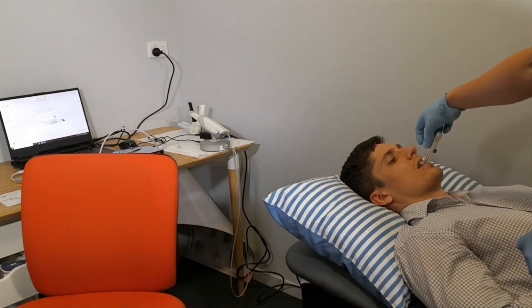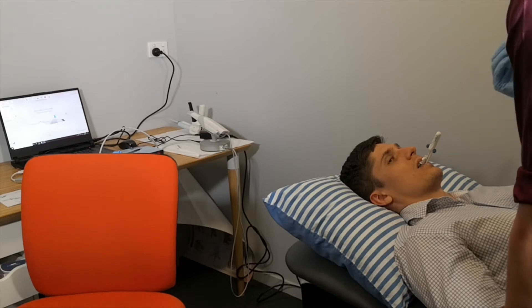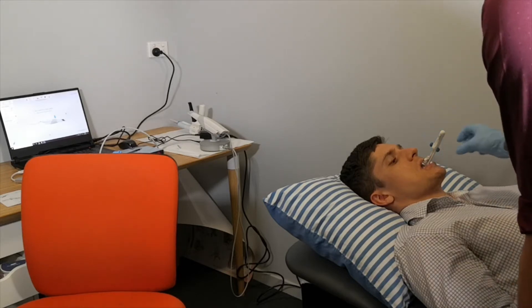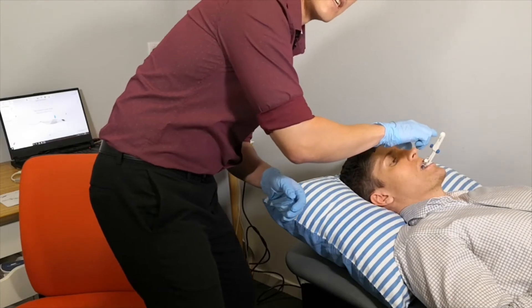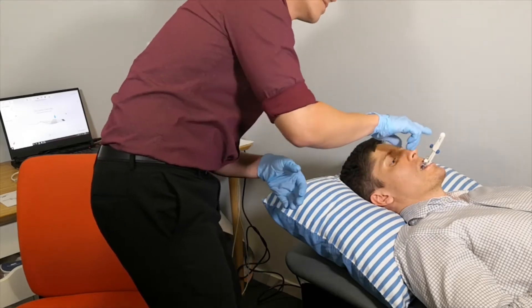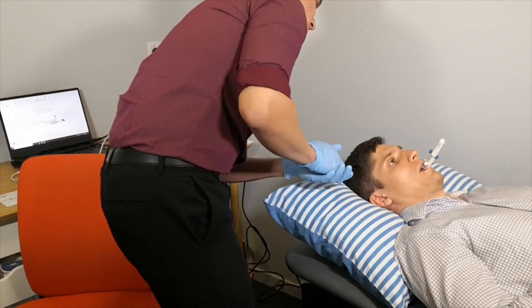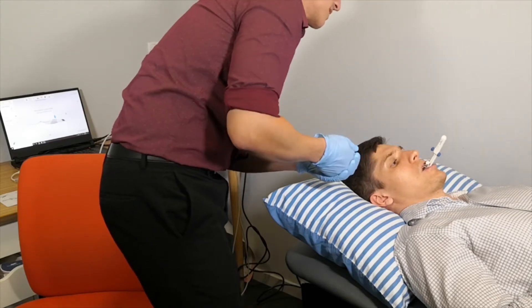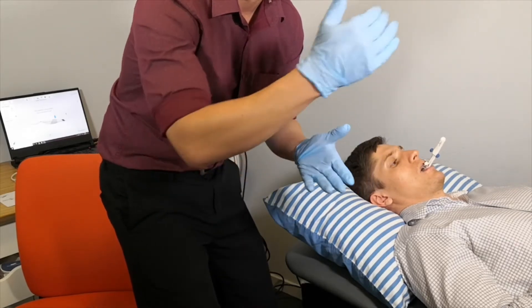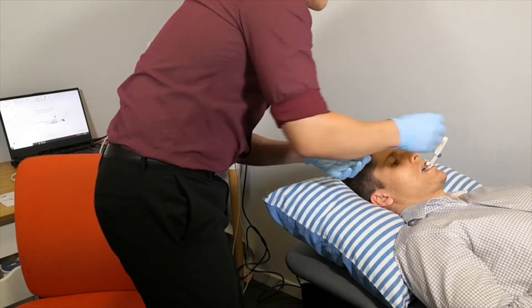Now the top part of the actual gauge is unlocked and free. I'm going to get Callum to protrude his jaw while biting on it — can you bring your lower jaw, your mandible, as far forward as possible? Now we can look at the actual ruler on the gauge itself to see how much into the positive, or how far forwards he can achieve. Take a note of that number, then get him to retract the mandible as far back as he can go. You get them to do it a couple of times so that we get a consistent maximum protrusion and consistent centric relation.